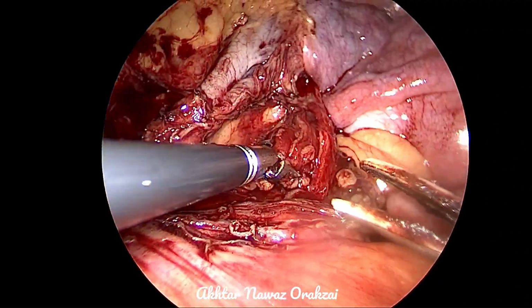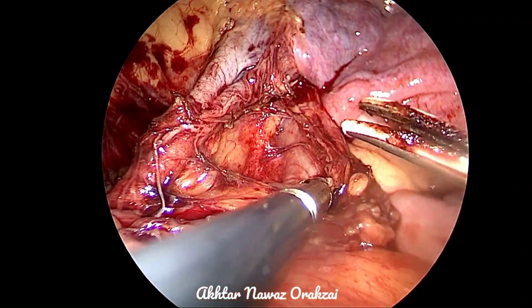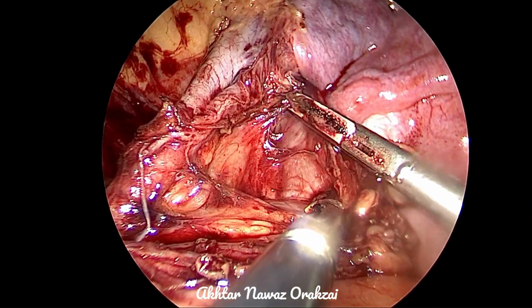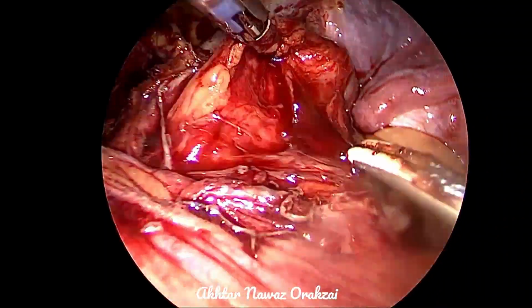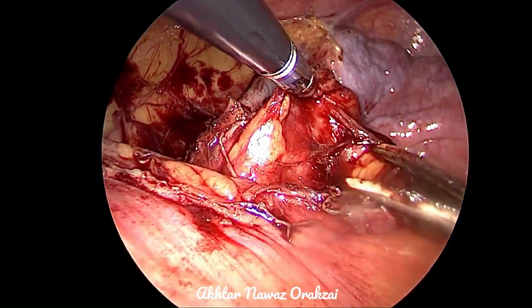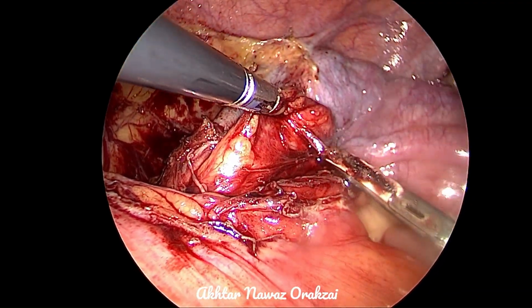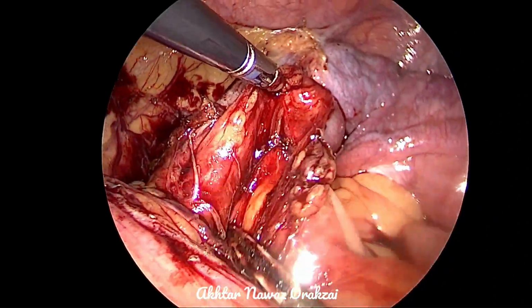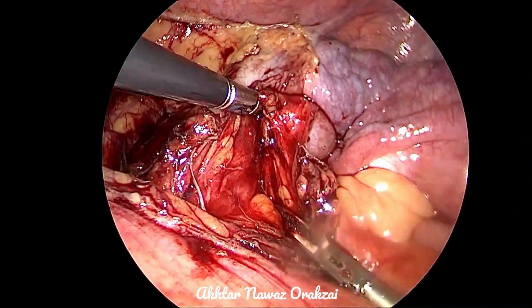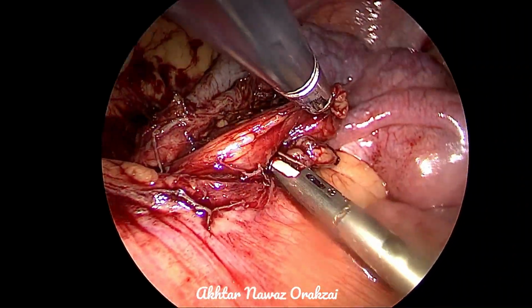Small blood vessels run longitudinally within the periureteral sheath, and thus maintain the blood supply. For any reconstructive procedure, vascularity is a must, because if the vascularity is compromised, reconstruction is most likely to fail.